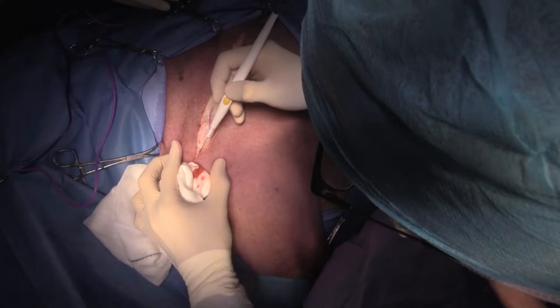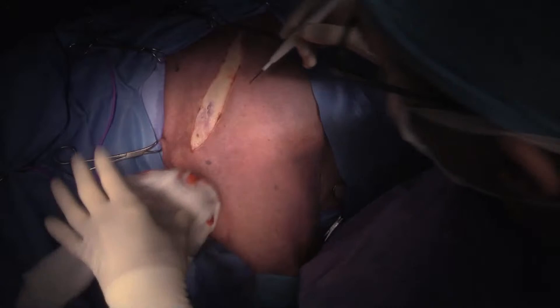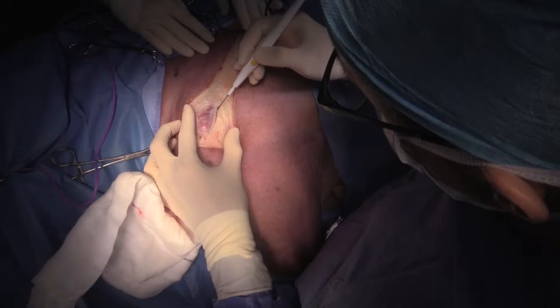My goal is to do this whole amputation and just use one lap sponge, but we'll see how we go. So this is omotransversarius here that I'm getting through.